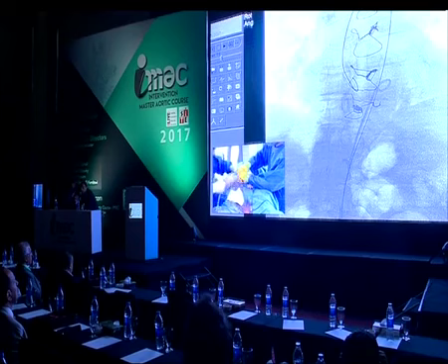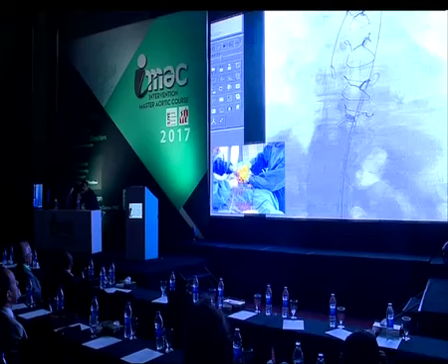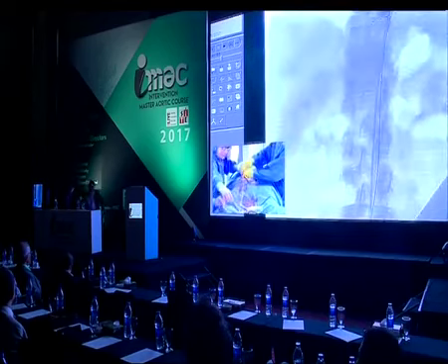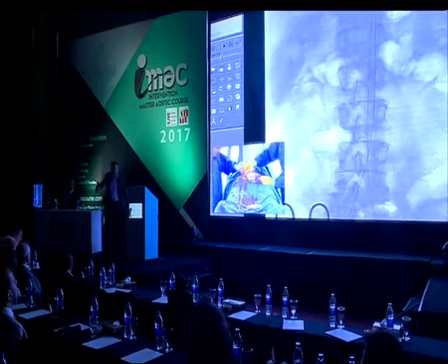Would you put a lumbar drain in this patient? Dr. Ayman? In this patient, you will put a lumbar drain. Why don't you just explain a bit?